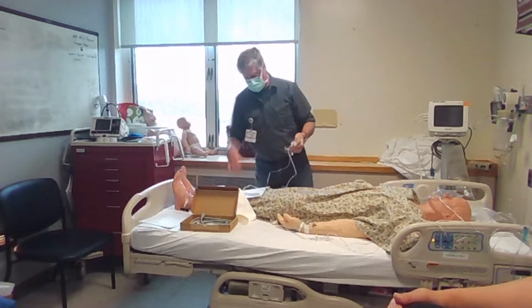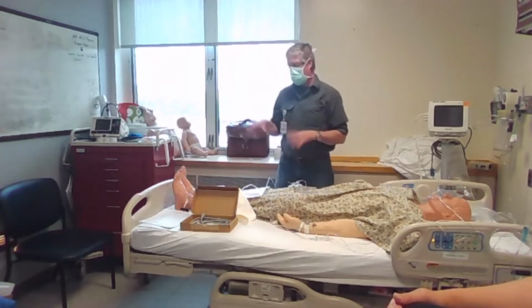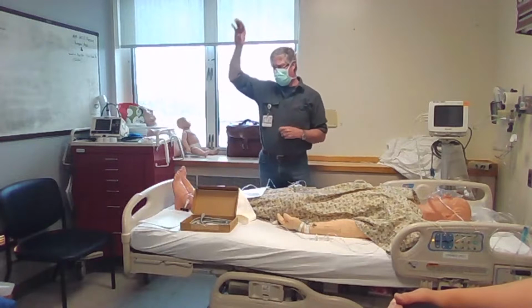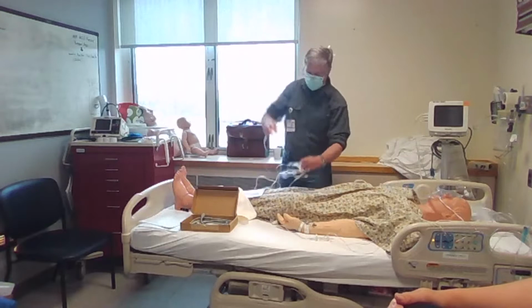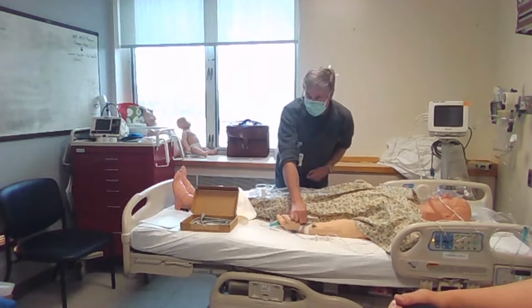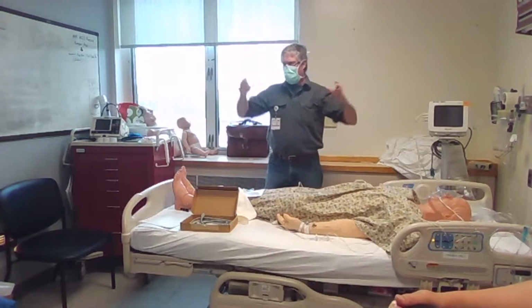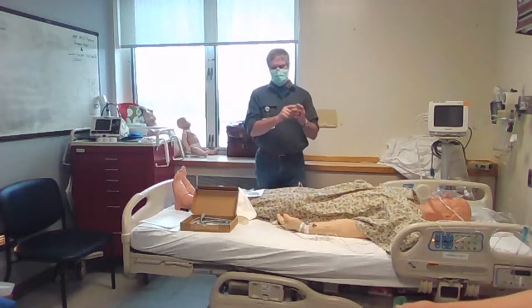One of the keys about setting up an A-line is you really don't want to get air in it, because air is going to dampen your signal, and we'll talk about that a little bit if it's something that interests you. But what it does is, you've got a solid column of water from your source all the way down through your transducer to your connection to the person right here, okay? And what that solid column of water does, it's not compressible. If you think about the physics of it, air you can compress into a cylinder, water you can't. So you can't compress it, so it gets a signal.